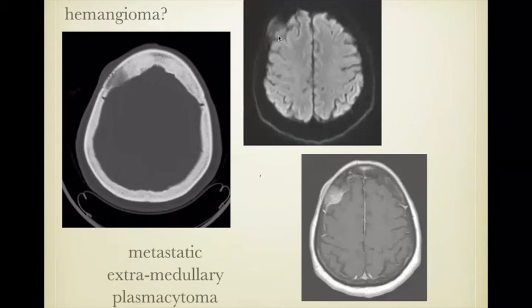Again, this is an unusual metastatic lesion in the sense that it doesn't have primarily bony destructive disease. I'll tell you, with diseases like lymphoma, this actually turns out to be an extramedullary plasmacytoma, but don't expect bony destructive changes in all cases of metastatic disease. So whenever you're thinking of calling it a hemangioma, be sure that you have very classic features of the hemangioma. Ideally, you might have old images, but if there's anything unusual about it, as in this case, the unusual component, you want to steer away from the diagnosis.